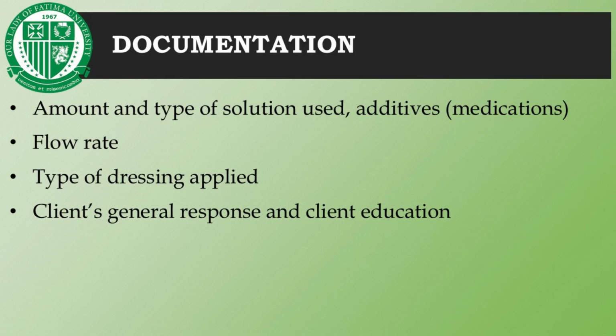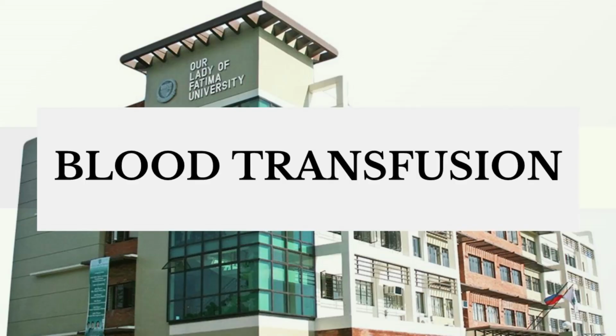Documenting the patient's response to the IV infusion, such as any discomfort, pain, or adverse reactions, and post-infusion instructions provided, such as signs of complications to watch for or when to notify healthcare staff.